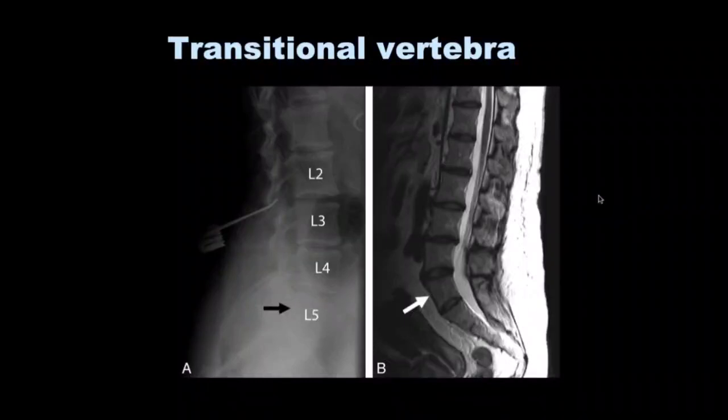Any specific protocol that needs to be taken in pediatric spinal trauma condition? I am not a pediatric radiologist, but having worked in the pediatric centers before, it's the T1, the T2, and the STIR sequences again. So the STIR would tell you about marrow edema. So even if you don't see a definite fracture line, that would just tell you about microtrabecular injury. A T2 weighted sequence is good for looking for cord or nerve injury, and the T1 is just good for looking at the anatomy and the ligament structures.